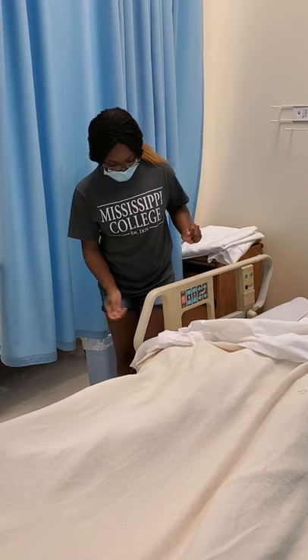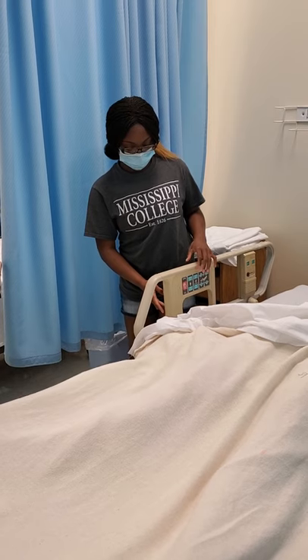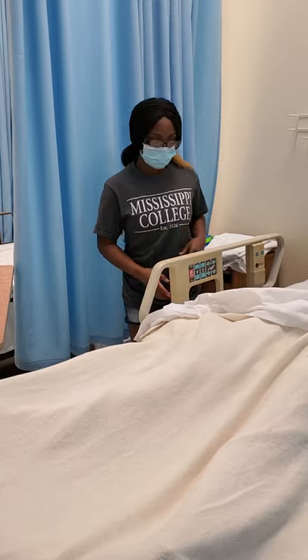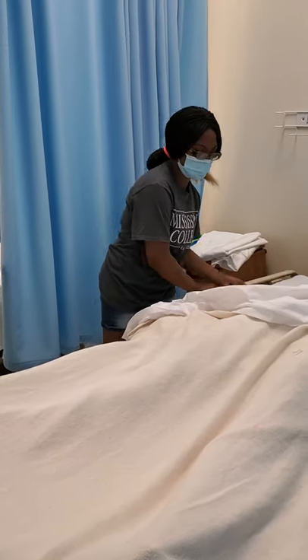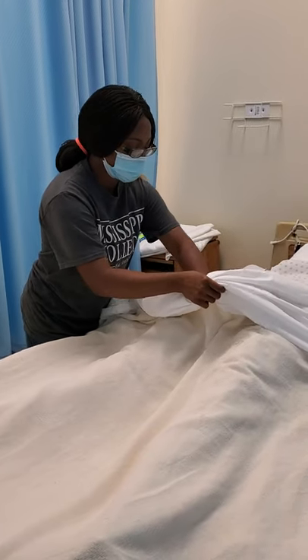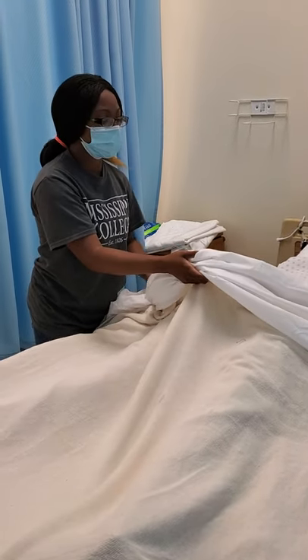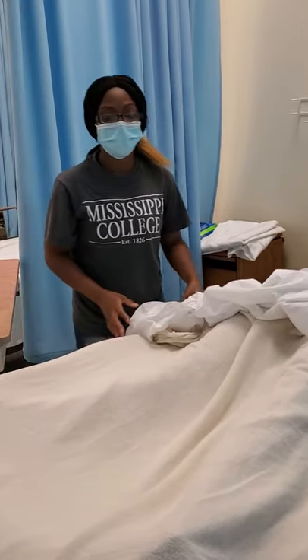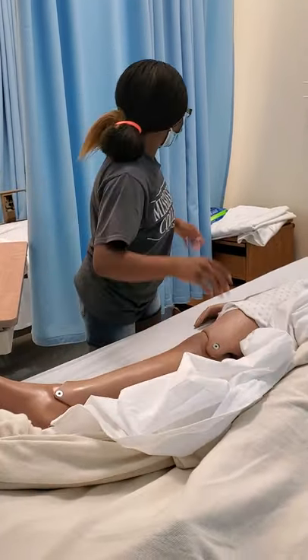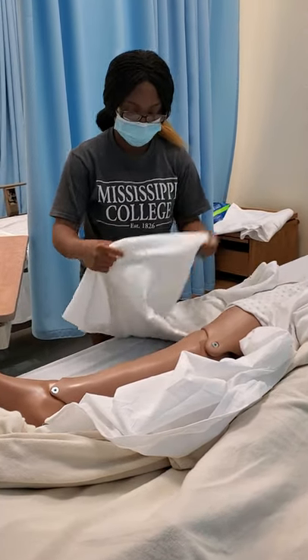Alright, now I'm going to raise the bed to a comfortable working height. Now I'm going to lower the rail. And now I'm going to see if my patient needs any perineal care. And she does not need any perineal care. All right, now I'm going to position my patient. And I'm going to cover her legs so that she's comfortable.